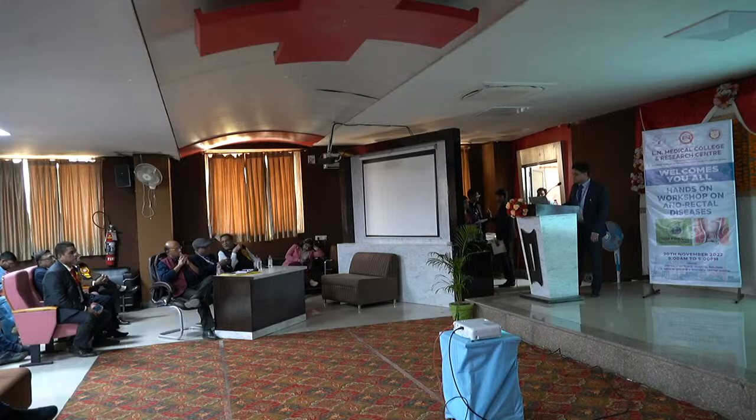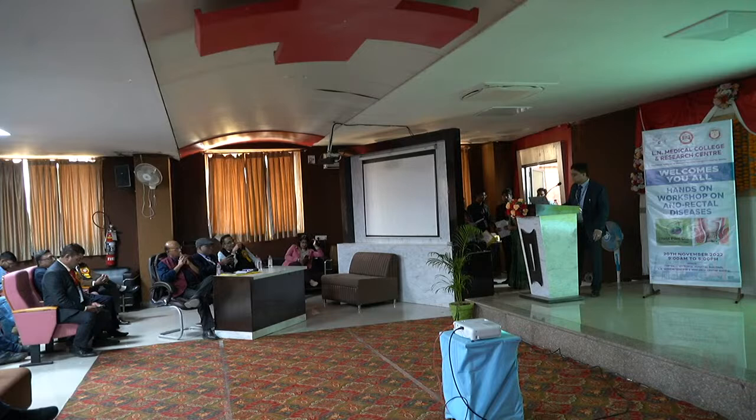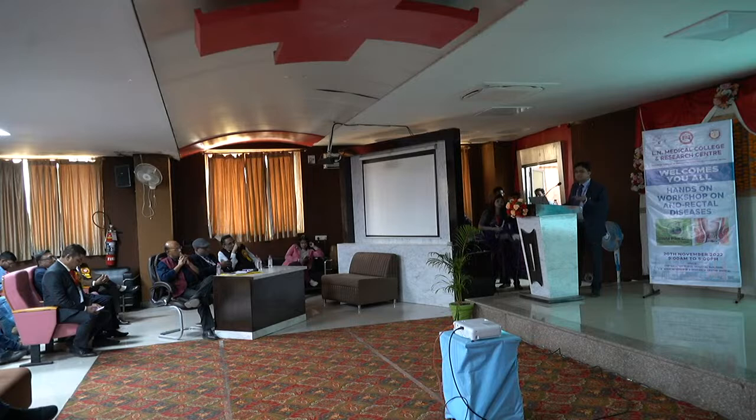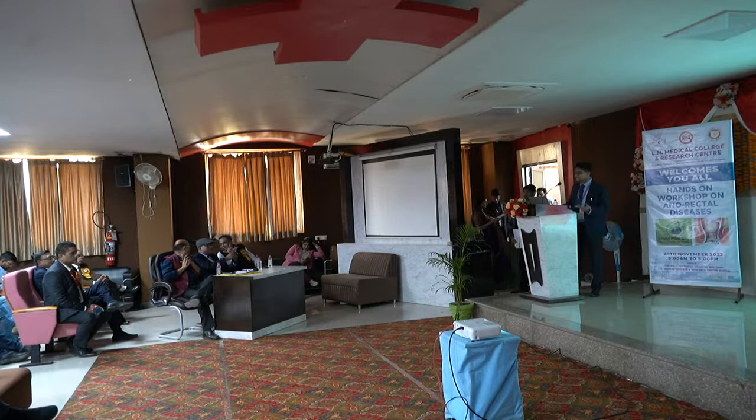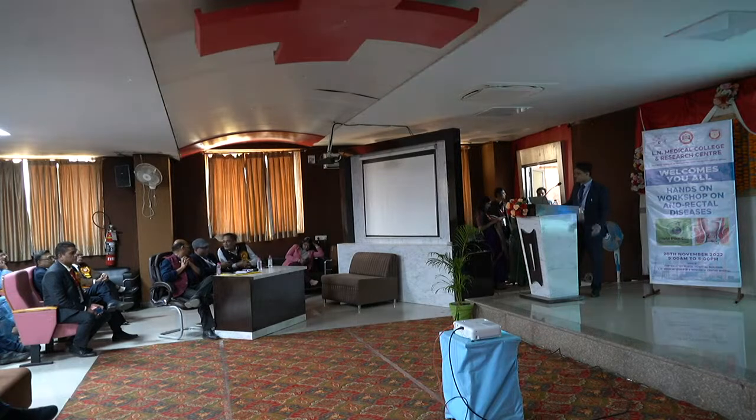This is the healing phase after 4 weeks. The laser technique steps are as mentioned by Dr. Rajiv Sagar sir. Fibrin glue we have used in fistula. The success rate is very poor, less than 50%. This is not a good idea. There are older techniques, and the sir has mentioned that this may be a good assisting tool, but not as a result by itself.